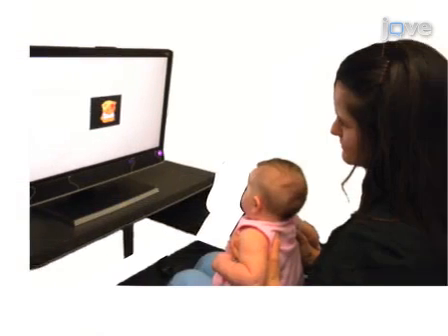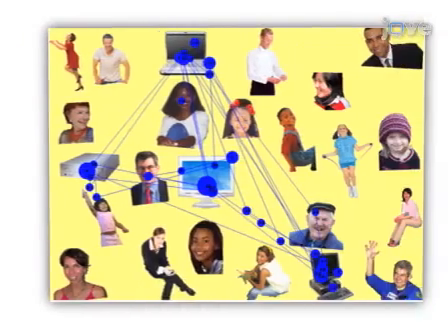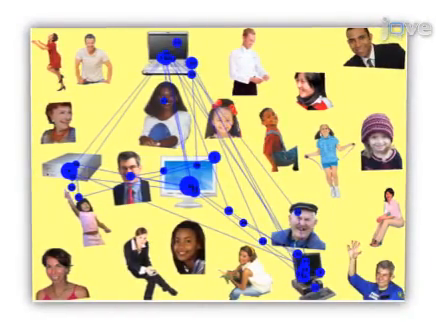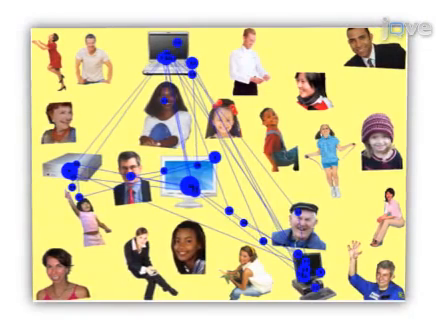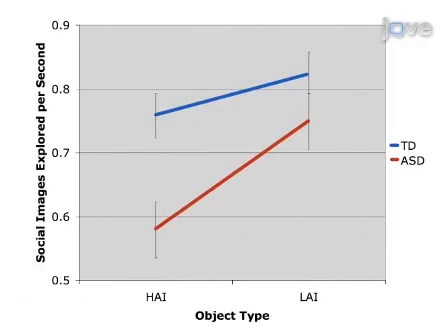As a second step, positioning the child for optimal eye tracking while maintaining his or her interest and compliance are crucial for obtaining high-quality data. Next, eye tracking data is analyzed in order to characterize metrics of fixation patterns or examine oculomotor properties. Results can show whether children with and without autism spectrum disorders differ in their visual attention patterns, a determination that is typically based on fixation analysis to areas of interest or inspection of saccade dynamics.